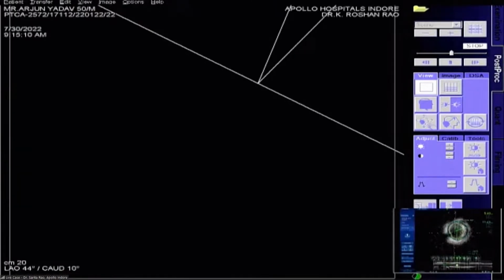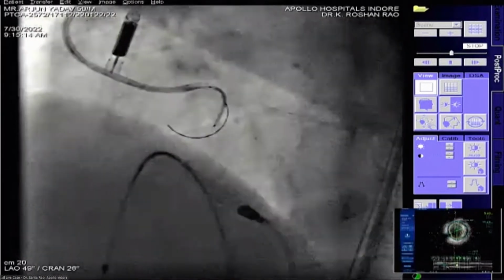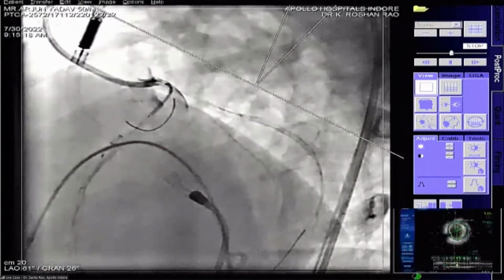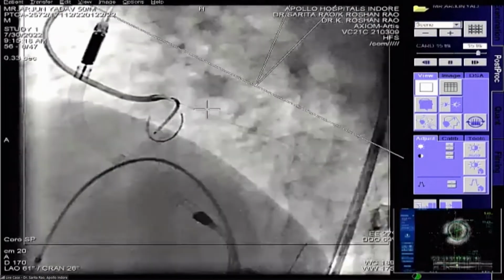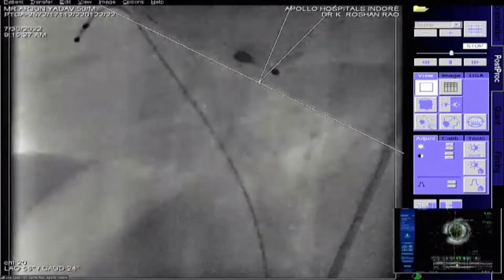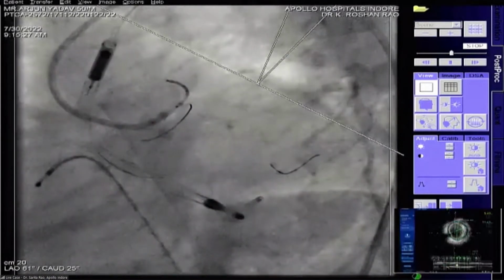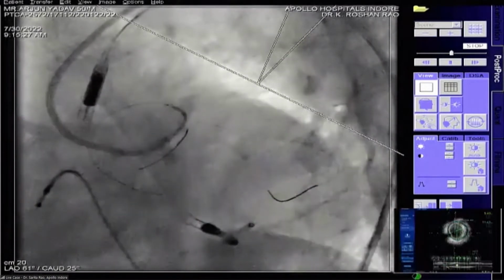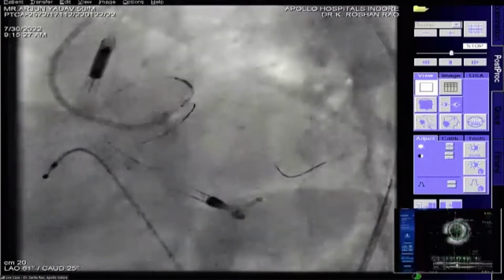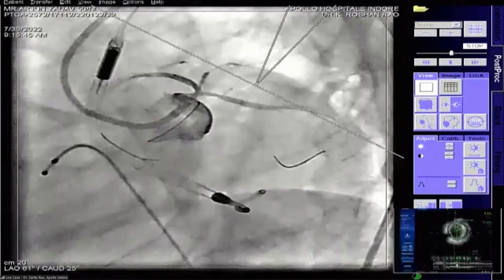Yeah, because there is a gap between the marker and the stent on the Resolute Onyx. My pressures will drop. Okay, short. Generally, if I have a sinus wire in, I can really abut my stent to the guiding catheter. I'm pretty sure it will never get in. Right, you can pull it back a little bit, Dr. Bansal is saying. Yes. When in doubt, you should err towards coming a little more proximally rather than missing the ostium. That looks good, Dr. Sarita. Yeah, I'm okay. Yes, deploy.